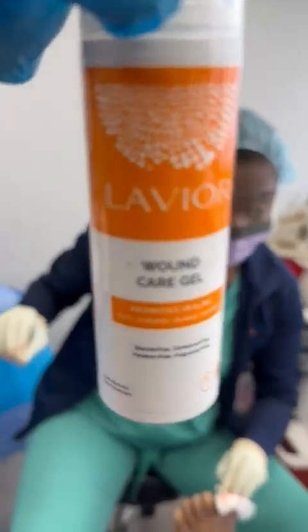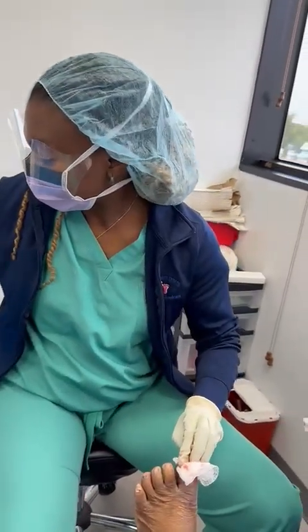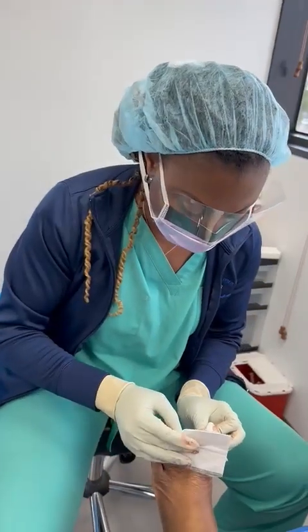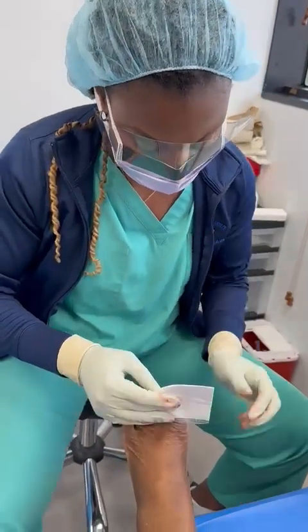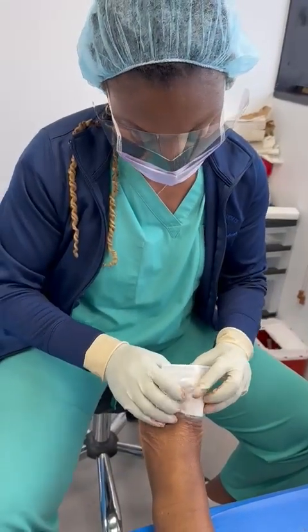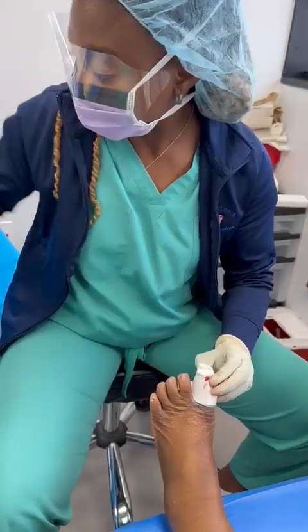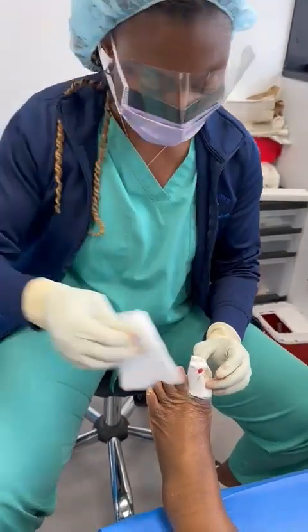So how do you feel? Feel pretty good? Good. Excellent. So now I'm just going to go ahead and dress it up. I'm just going to put the hydrogel on it. Okay, just put it all over it. And the patient can see me doing it so they can repeat the same procedure at home.